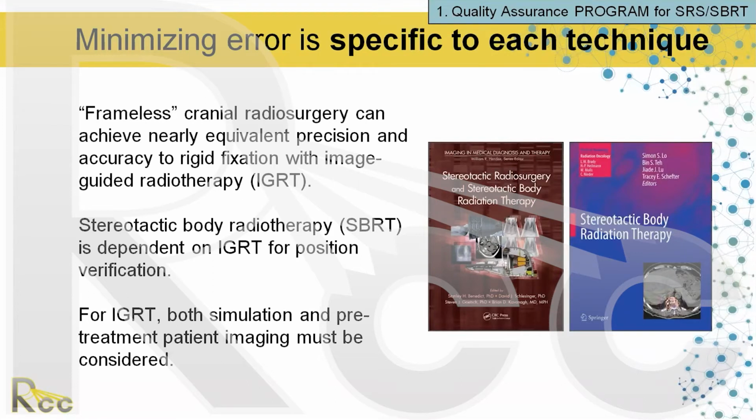So each technique is a little different. I think that's important, I'll reiterate that. Brain is not the same as lung. It's not the same as liver. So you want to tailor your program for each one of those things. We're kind of talking more about cranial today. It's kind of more of the focus.